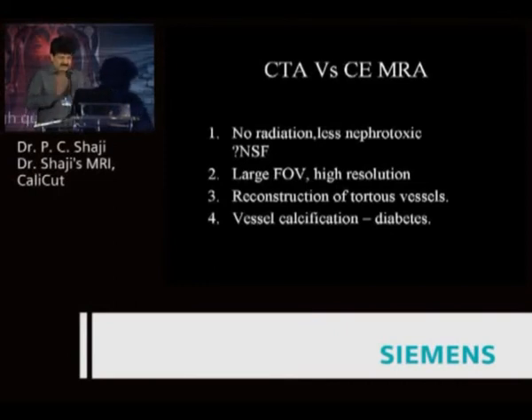So when you have TWIST, or whatever name somebody calls it, you get a high temporal resolution which can be used to evaluate AVMs or shunts or areas where you have venous contamination problems. So the temporal resolution of MR angiography is higher than CT angiography if you have TWIST or time resolved techniques.